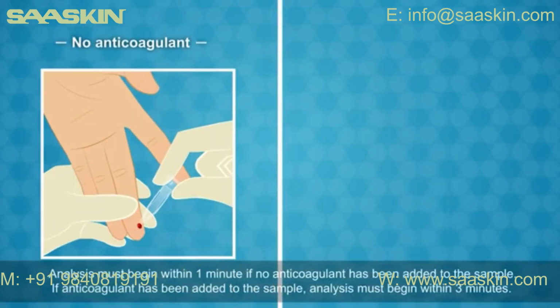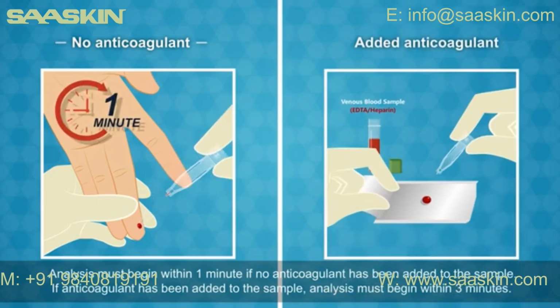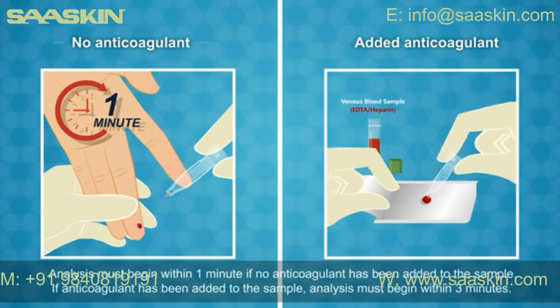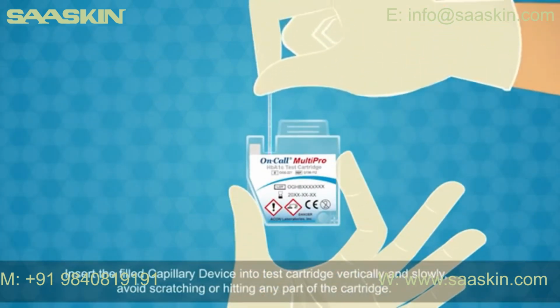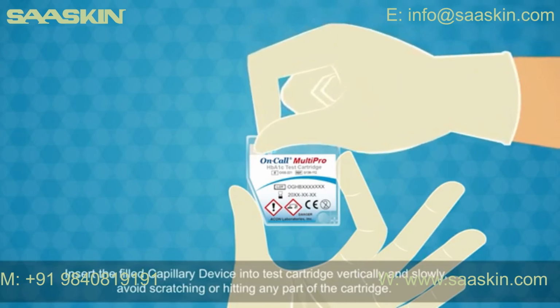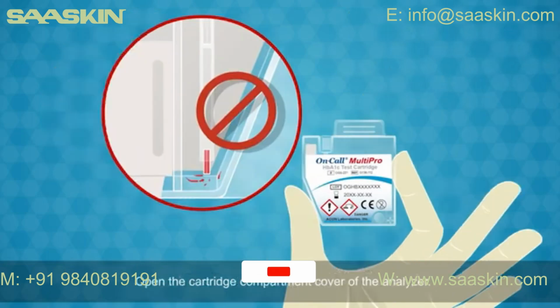Ensure the capillary tube is fully filled. Analysis must begin within 1 minute if no anticoagulant has been added to the sample. If anticoagulant has been added to the sample, analysis must begin within 3 minutes. Insert the filled capillary device into test cartridge vertically and slowly. Avoid scratching or hitting any part of the cartridge.